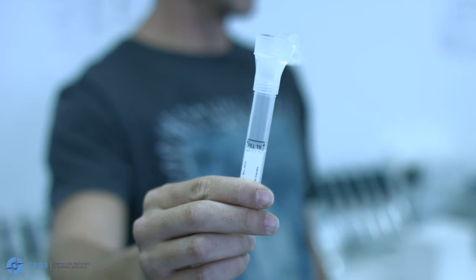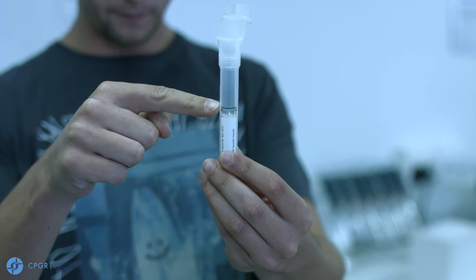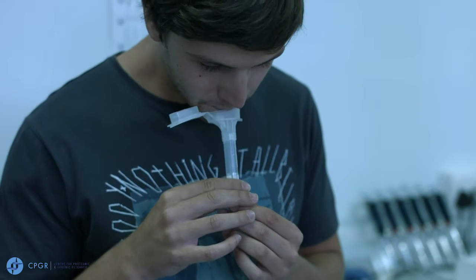The amount of saliva needed must reach this fill line. Spit directly into the container.